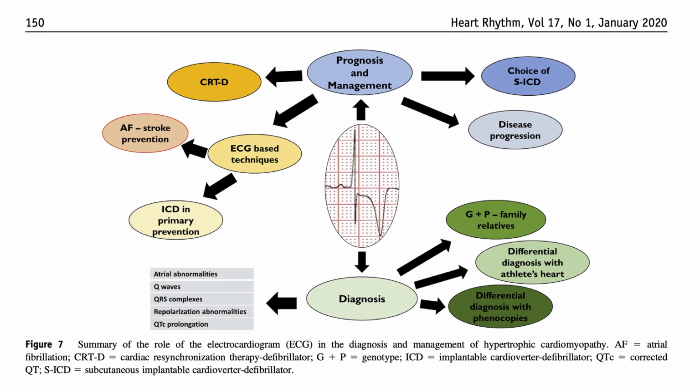Despite recent exponential development of imaging techniques, a learned interpretation of the ECG provides invaluable clues in the early identification of the disease, the differential diagnosis with the other causes of left ventricular hypertrophy, or with physiological adaptation in highly trained athletes, and detection of features that may suggest a high risk of adverse outcomes.